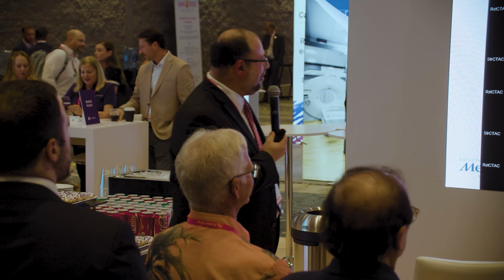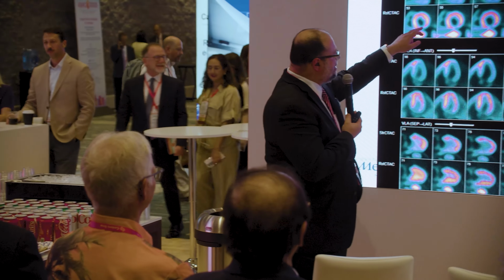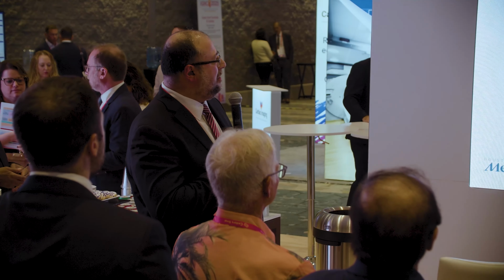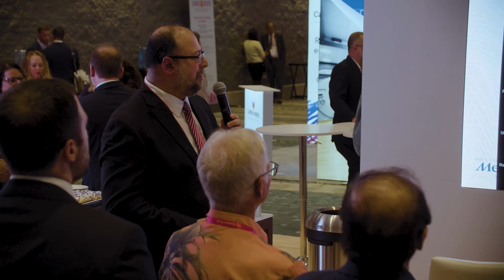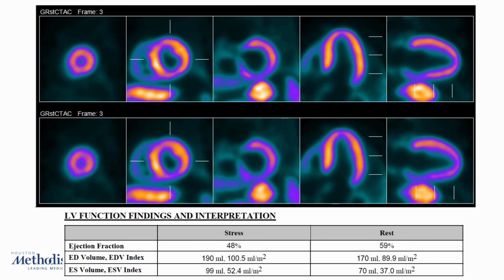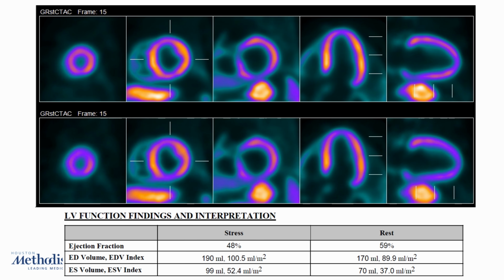So there is also some aspect of it that's relatively fixed there. So you see some fixed element there. Although I have to say, yeah, and also it's in the apical too. But in the basal, there is an element of fixed defect which probably corresponds to the area that is... Sometimes we see that in chronic lesions and ischemic lesions, but sometimes you can see it also in severely ischemic lesions.